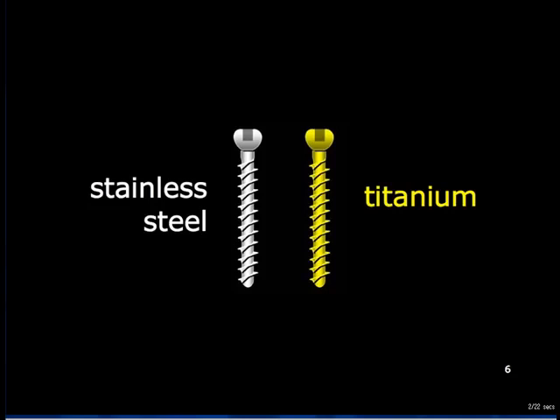One of the basic attributes of surgical screws is the material of which they are made. Most are metal, either stainless steel or titanium, there being inert, or virtually inert, in the body tissues. Of course, biodegradable screws are made of a variety of materials that are not inert in the body tissues, as they are designed to be absorbed slowly.